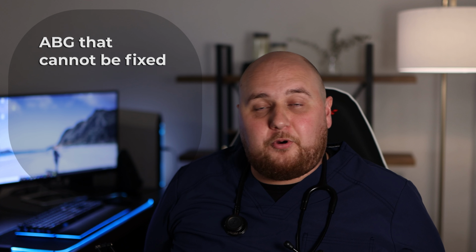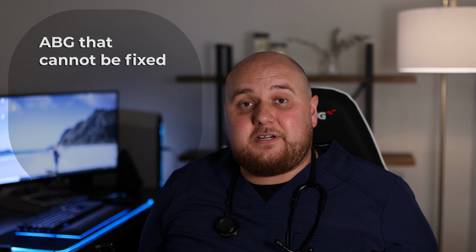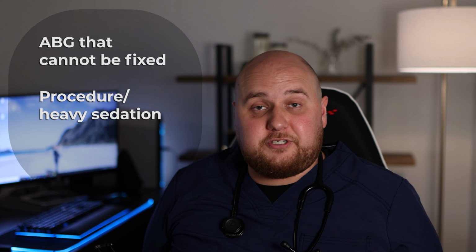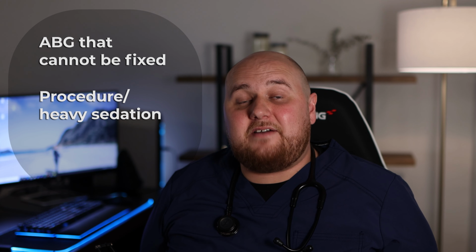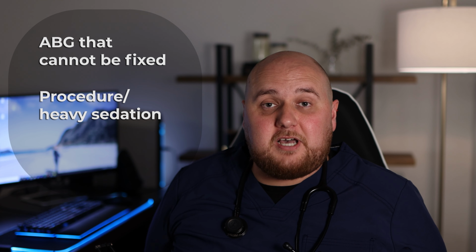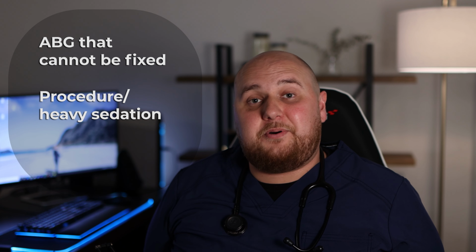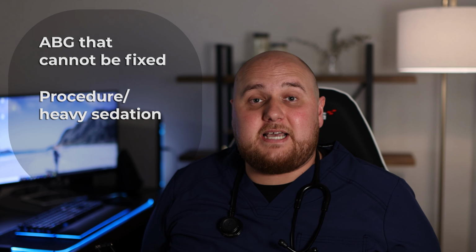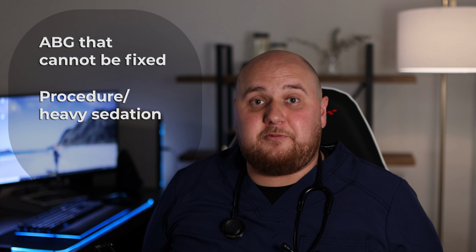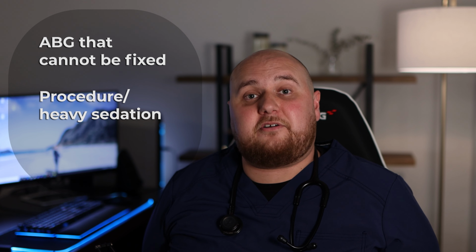Now, other important reasons why people get intubated is sometimes they're in a procedure, and after surgery or after some kind of operation, they need to maintain their airway because they're heavily sedated. So a post-op patient is going to usually come out on an endotracheal tube. We're going to put them on a mechanical ventilator until they start waking up. We do a quick few tests, and most likely they're going to get extubated within 24 hours. But that is another reason that a person goes on a mechanical ventilator.